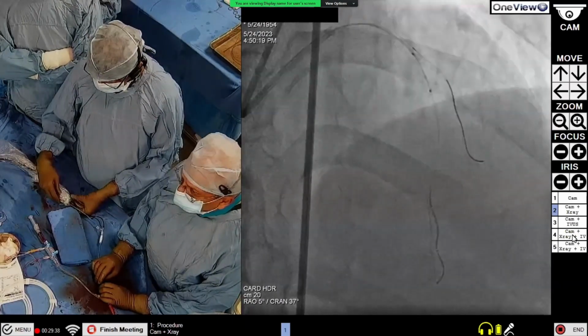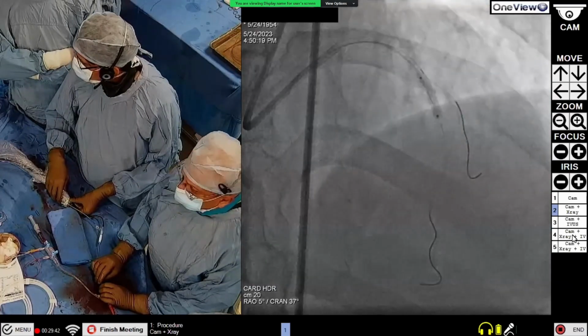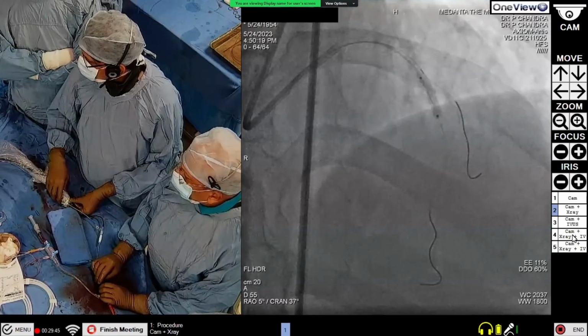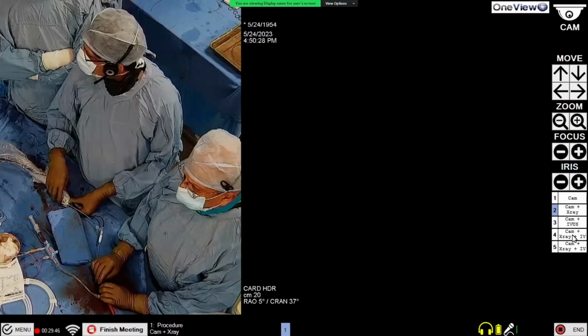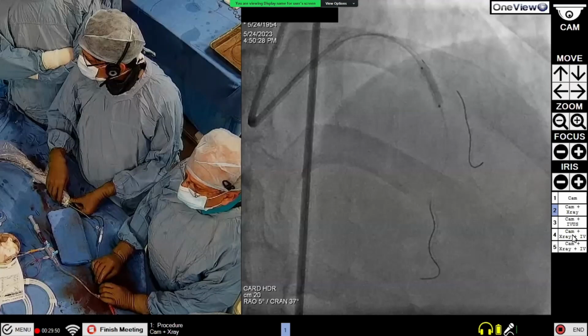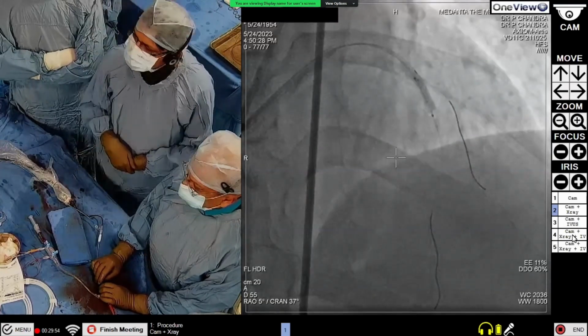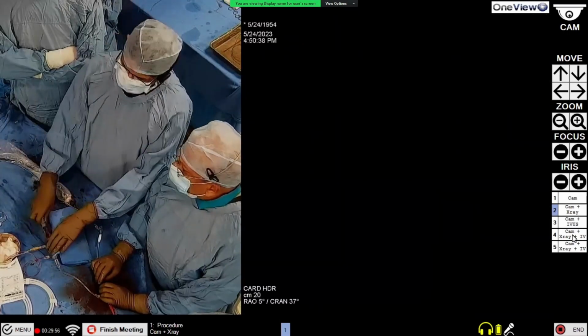Starting pulses 39, 38, 37, 36, 35, 34, 33, 32, 31, 30. Stop. Deflate. Deflate.